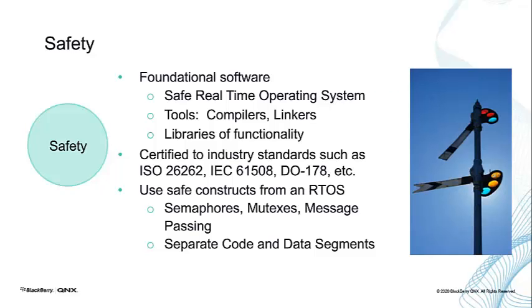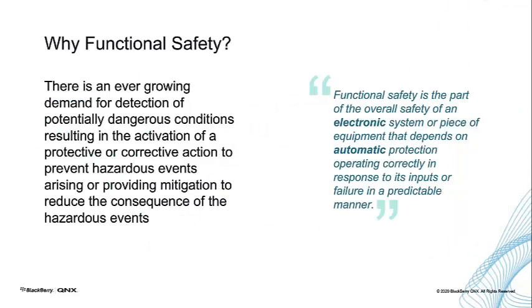Now, you may have heard the term FUSA, or functional safety. That's a very important concept, and it has to do with what ifs. What if the software fails? Or what if a hardware sensor goes out? How do we mitigate those risks in the system? So you might have something that's mission critical that if it fails is catastrophic, but you can put in a monitor that's monitoring, saying, are the results coming back from this sensor correct?